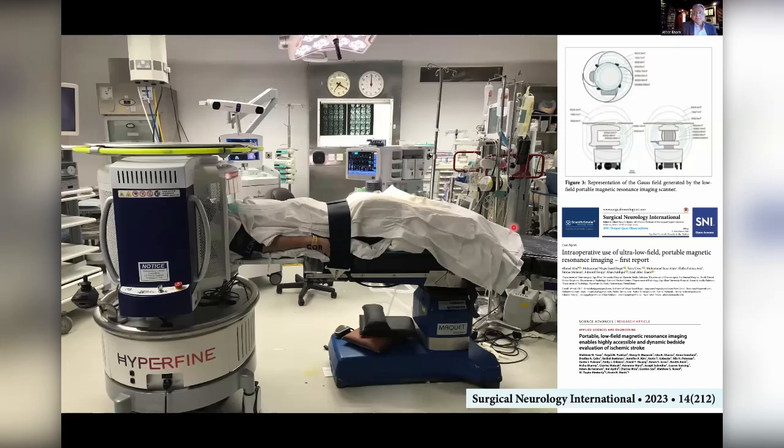And the most interesting thing was that it was unthinkable to do an intraop MRI in an LMIC in a resource limited setting, and even in North America, not every institution has an intraop MRI. But using this machine with such a small footprint, and the Gauss lines are so narrow, we could just bring it in. I did not have to change my instruments. We just moved the machines a few feet away from the patient. This is the operating table the patient was on.